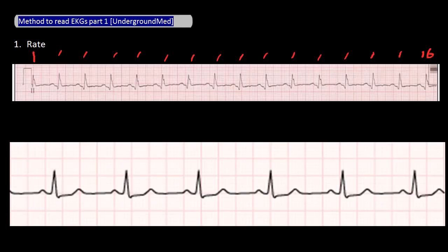For example, here there are 16 QRS complexes. Taking 16 and multiplying it by 6 gives us a rate of 96.